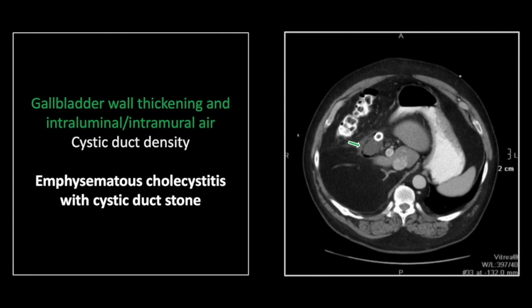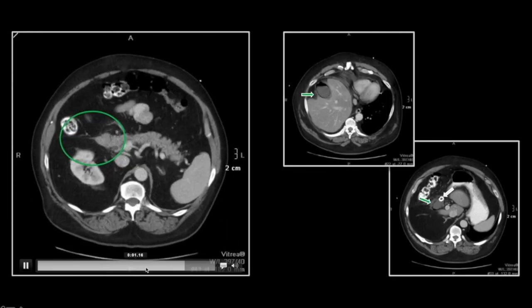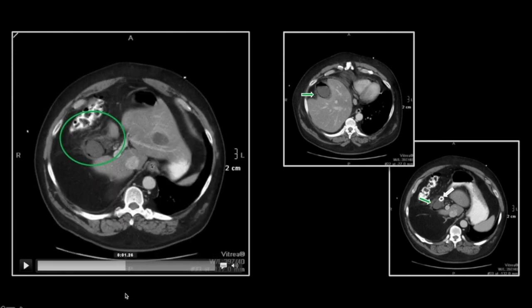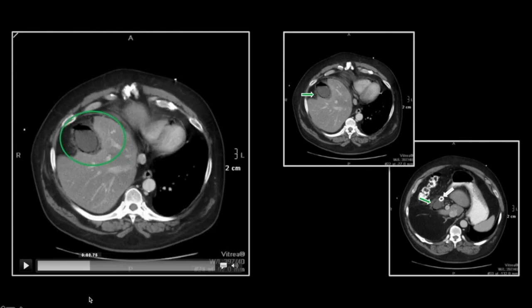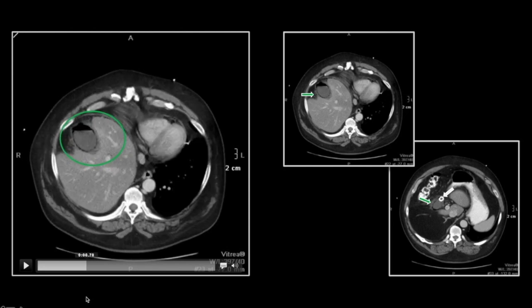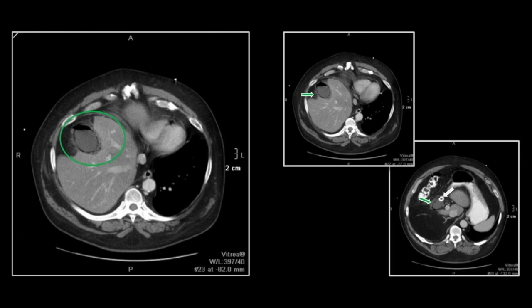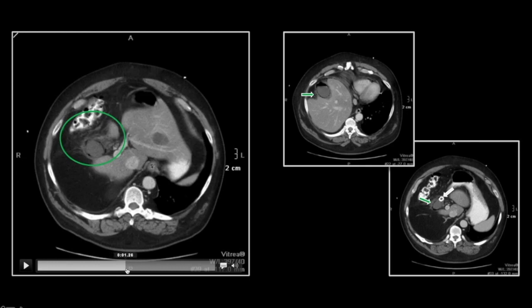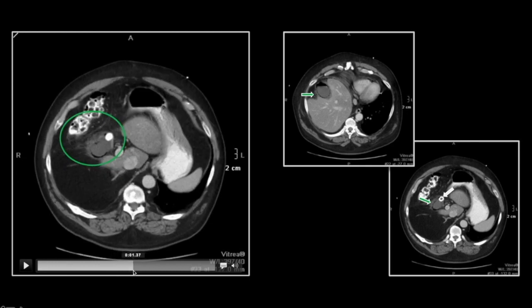Here you can see the culprit is this stone in the cystic duct, and right down to the neck of the gallbladder we still see the intraluminal gas. Note there is extensive stranding surrounding the portal region. Here is the intraluminal and intramural gas outlining the entirety of the gallbladder. There is the layering fluid level, and it looks as though the gallbladder wall is just about to perforate there in the fundal region. And again, this stone lies right at the neck at the base of the cystic duct.